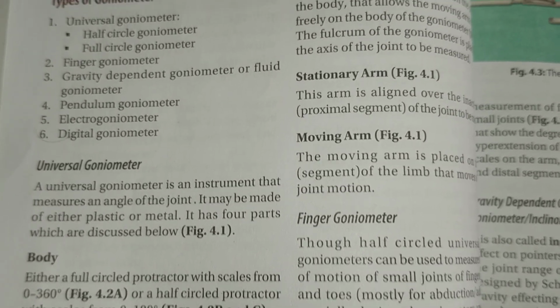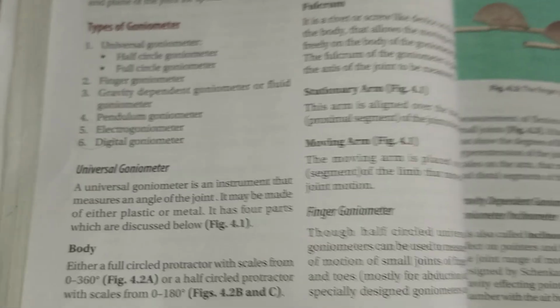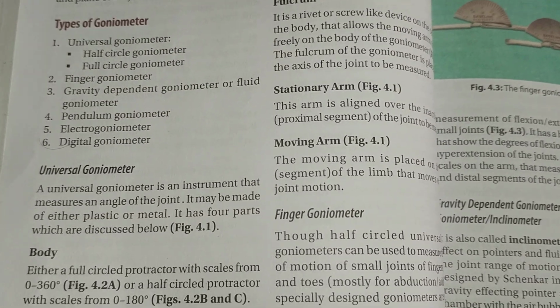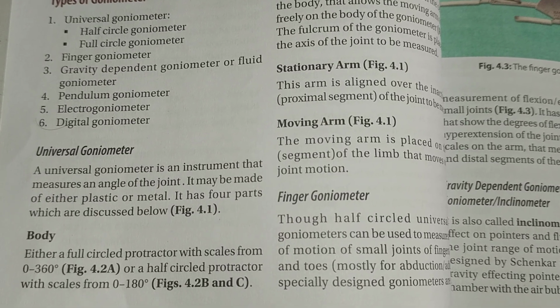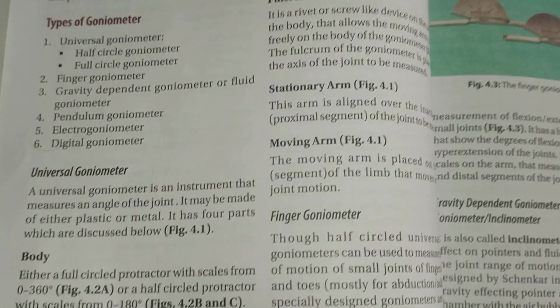What are the 4 parts? Body, fulcrum, stationary arm, and moving arm. These are the 4 parts of the universal goniometer. The body is either a full circled protractor with scales from 0 to 360 degrees or a half circled protractor with scales from 0 to 180 degrees.